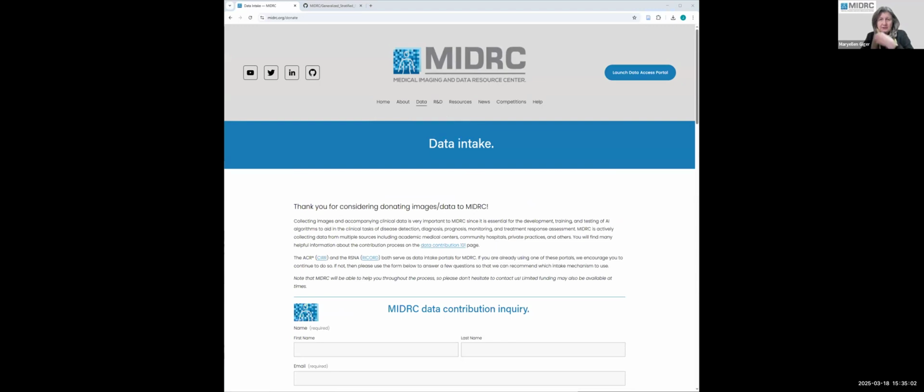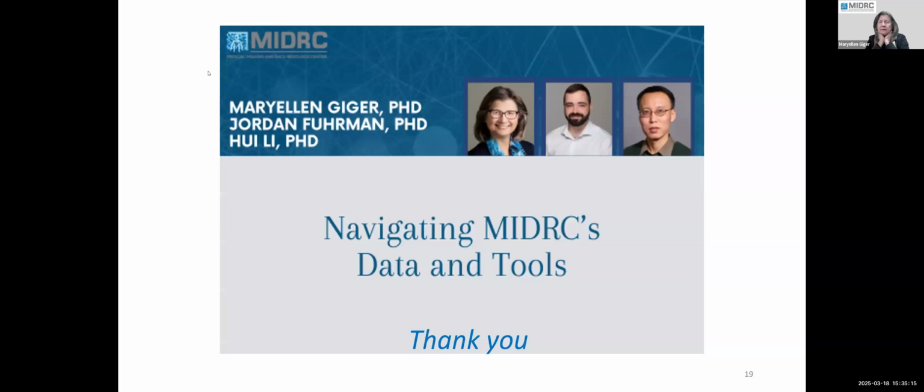The other questions. So I'll ask a question to Jordan, you've used some of these in your research. How user-friendly are they? We even have summer students using them. Maybe if you want to give a user perspective on the ease and the back and forth feedback.